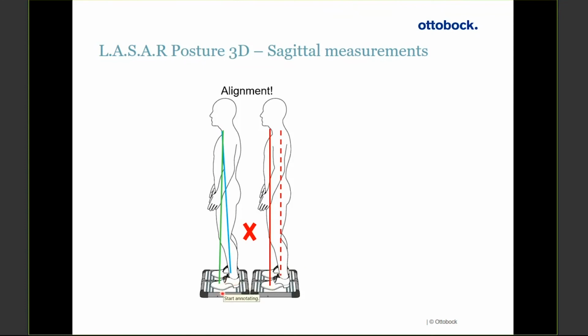This is quite common, especially once we've established our bench alignment. Normally at Ottobock, when we do bench alignment, we put an extra 5 millimeters under the heel of the prostheses. And what this does is slightly plantarflexes the foot. So when the patient stands in a static situation for the first time, that plantarflexed foot is going to create an extension moment at the knee.